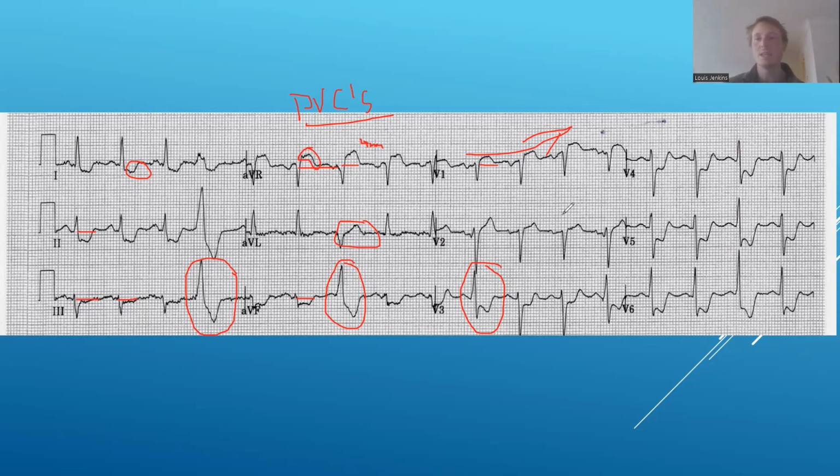Obviously, if a patient's clearly having an infarct, then get them to hospital, get them to PCI. That should be the number one thing on your agenda there. And try and get some good tracings en route if you can. But if you can't and you've got that clear pattern, that means they're indicated. Just get them to hospital. But if you can afford to take your time, try and get a high quality ECG. Makes the rest of this a lot easier.